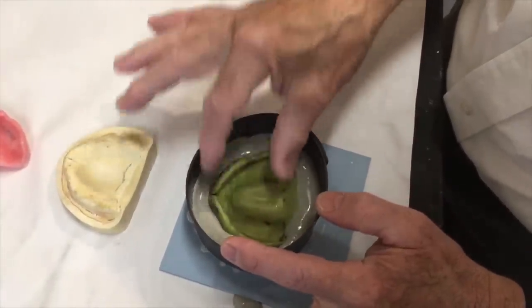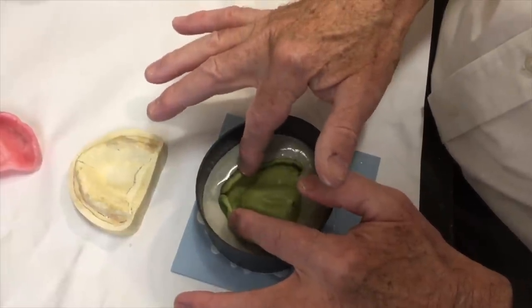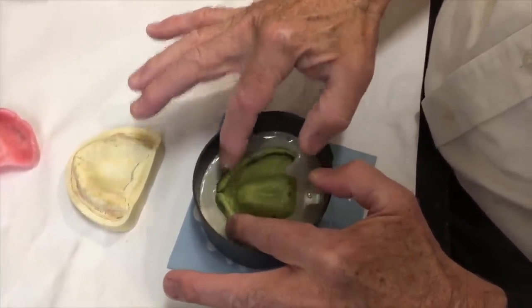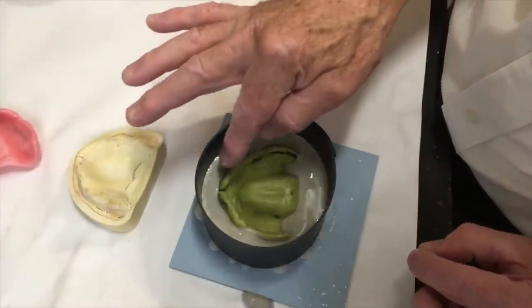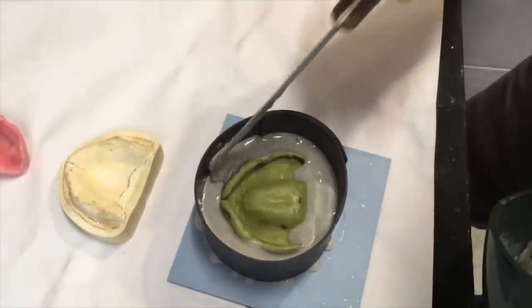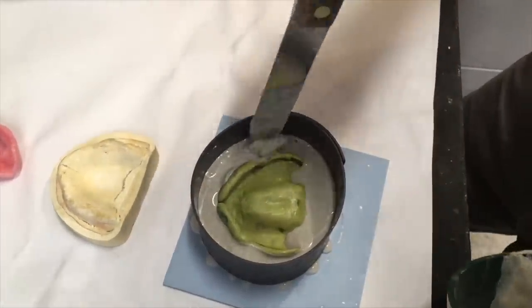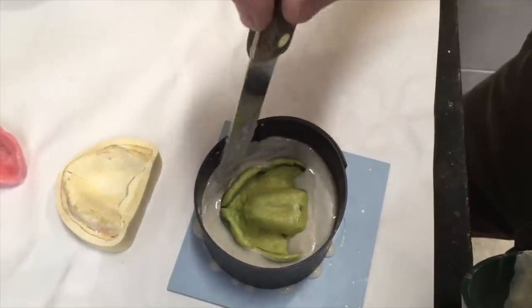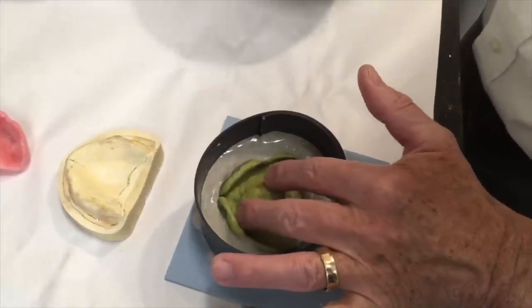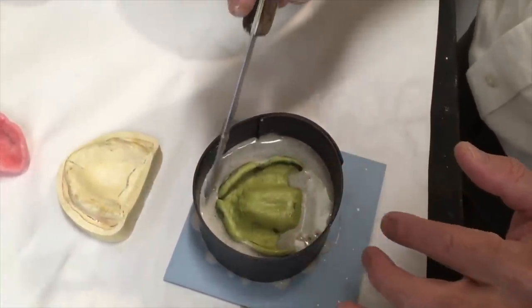After it sets it's going to still be soft because of the pumice in with it, so I can refine it and carve it down. If you don't have enough, I can add a little bit more because I'm going to refine that before we pour stone in here. It looks good — I'll just let it set. Because it's got quick-set plaster it's only going to take about seven minutes.